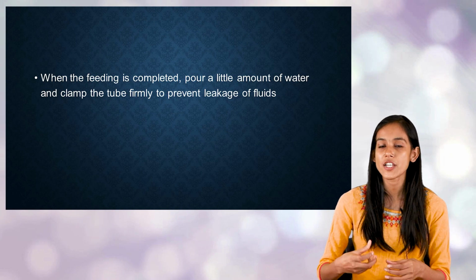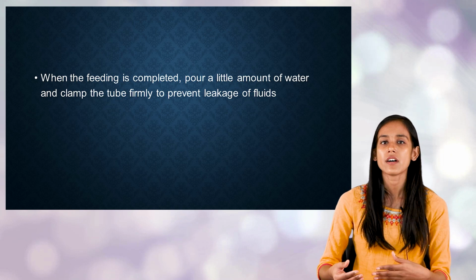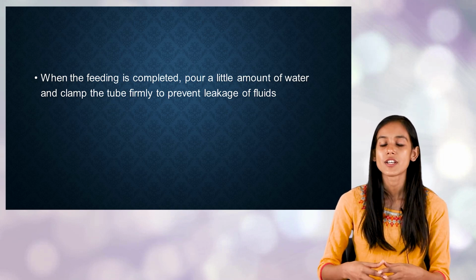So once you are done with providing the nutrients or the food to the child, then you are going to flush out the tube with 10 to 20 ml of water, or however it is advised by the physician. So we have to flush out the tube.